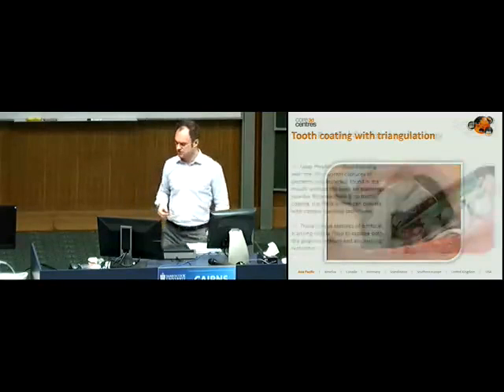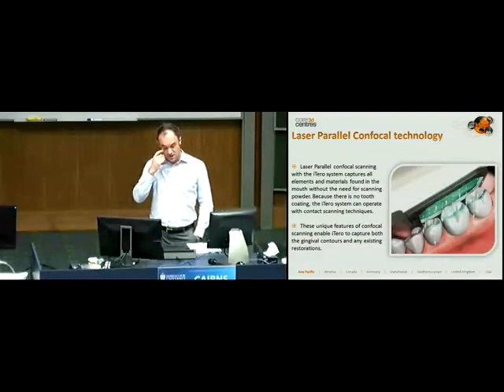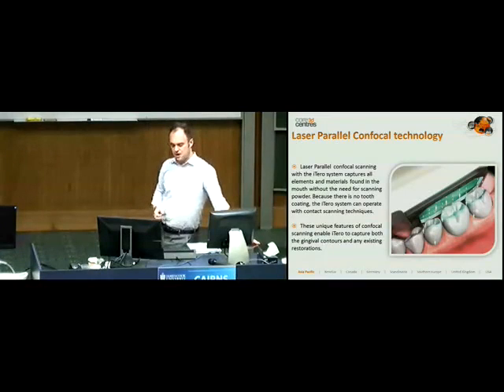The technology that's been developed in the ITERO system, and also in a couple of the systems that we're involved in the research and development, is a technology called parallel confocal. It's used extensively in microscope technology. I'm not going to try and explain it because I barely understand it, but effectively what the scanner does is send out a beam of light. It's 100,000 points of laser light, and as it's sending out that light, there's some micromotors in the unit that move the light source away from the lens, so it's able to effectively capture in a video feed 300 focal depths. So there's effectively 300,000 reference points, but it only allows parallel light back in.